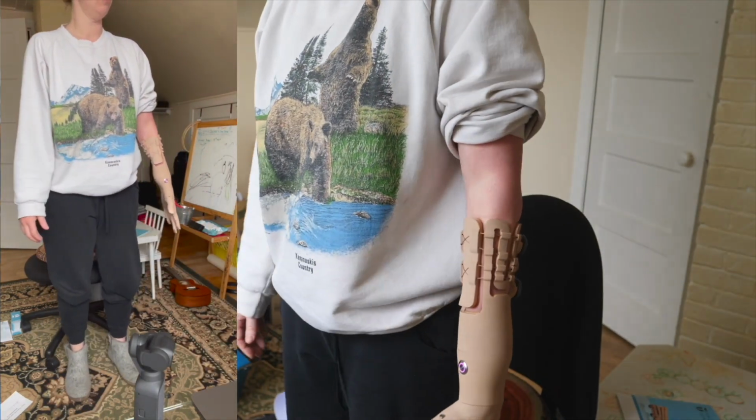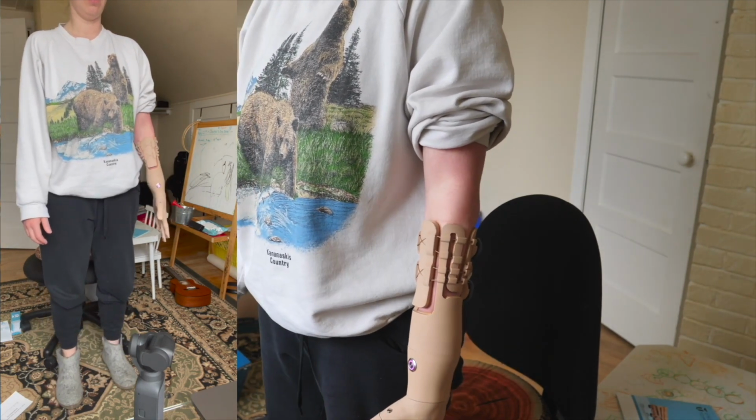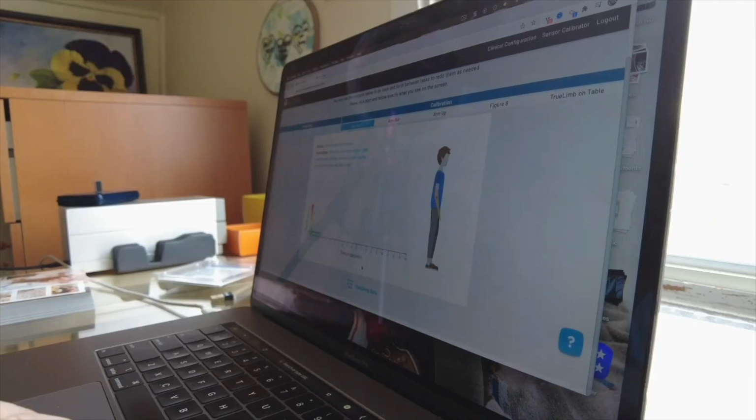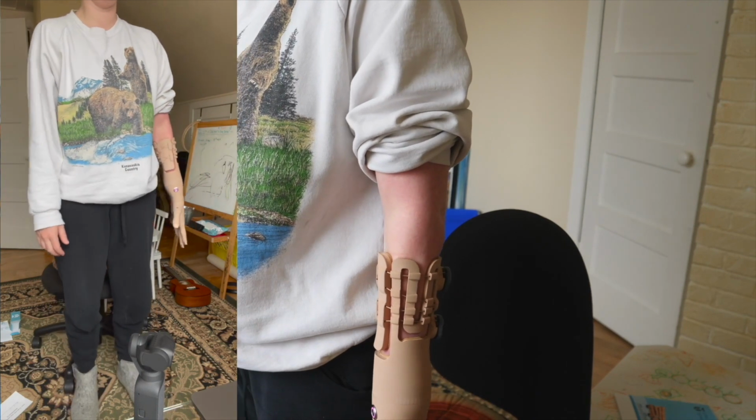Okay, holding arm down by his side. Okay. Now it's downloading the data. I did that right. I did it right, I think. I don't know. Good. So it says sensitivity has been adjusted. Wonderful. Oh, I already did this one. Do I do it again? I'm so confused.